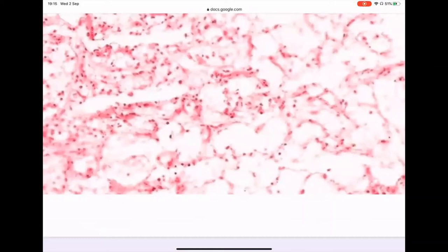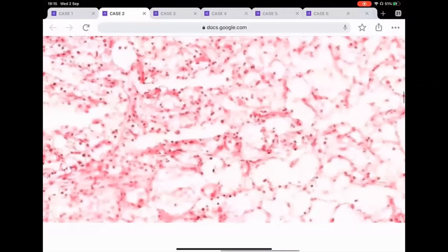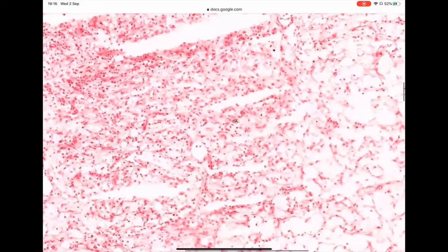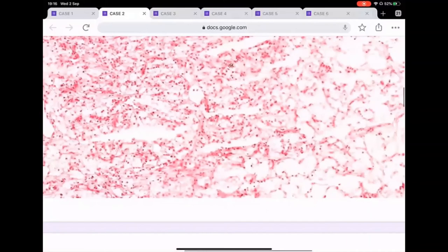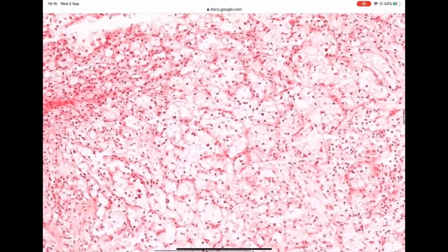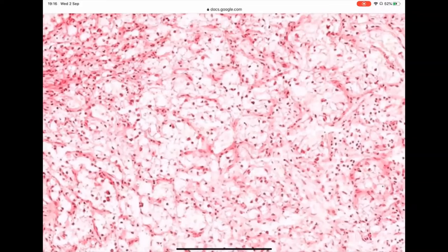So one of the things in frozen section that I do find difficult is to define if there are definitely fat cells or not, but it can be quite deceiving, because you can go along there and decide, okay, there are some spaces which might look like vessels, maybe some fat, but look, we go to more areas. And this is one of the things that you need to appreciate when you look at frozen section, that some part of your section will be better fixed than other parts. And this is the nature of it.